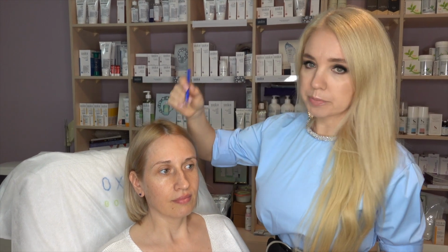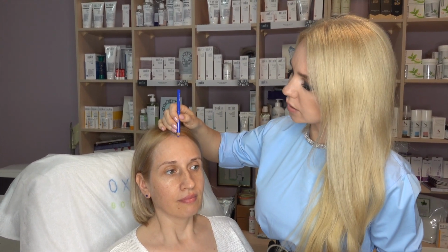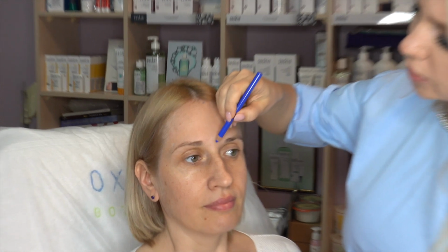Let's discuss our plan for the second stage with fillers, and here my goal will be to highlight masculine and feminine features, because here we can see an overall combination of yin and yang features. Let's start with the patient assessment.